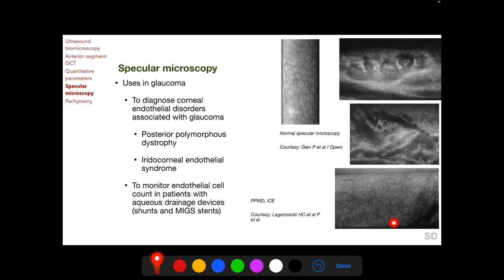A specular photomicrograph of iridocorneal endothelial syndrome shows reversal of the light-dark pattern. Posterior polymorphous dystrophy and ICE syndrome will be discussed further in both the glaucoma section and the cornea section. Another use of specular microscopy in glaucoma is to monitor endothelial cell count in patients who have undergone surgery with aqueous drainage devices such as shunts and MIGS stents, as these patients are known to have a decline in endothelial cell density following surgery.